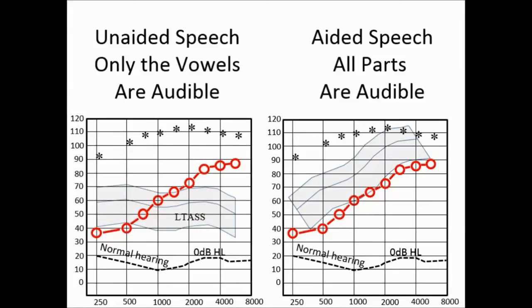So the frequency response of your hearing aid might be doing one thing in quiet. It's going to be producing a slightly different quality of sound in noise. Plus, in noise, you're going to want your microphones to behave like a funnel, like right in front of you. Assuming the person you want to hear is in front of you, you'll want your hearing aid microphones to be most sensitive to sounds in the front, as opposed to the sides and the rear.